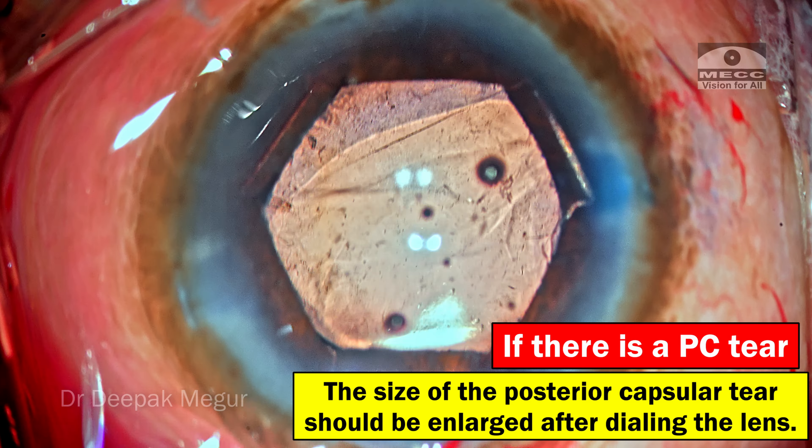Time to remove the OVD. As I go in to irrigate, I see something fluttering in the pupillary area. It's vitreous, which has prolapsed transzonularly. I'm using diluted triamcinolone acetonide to stain the area so that I can identify the individual vitreous fibrils.